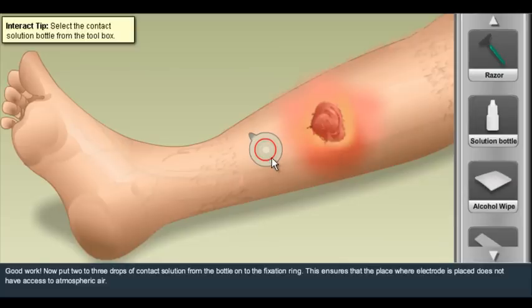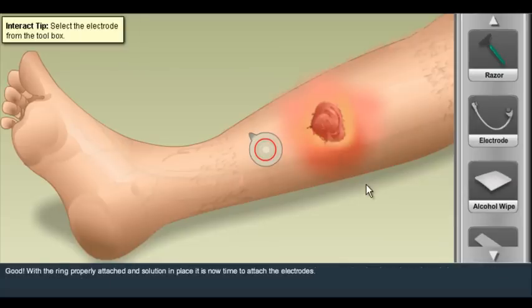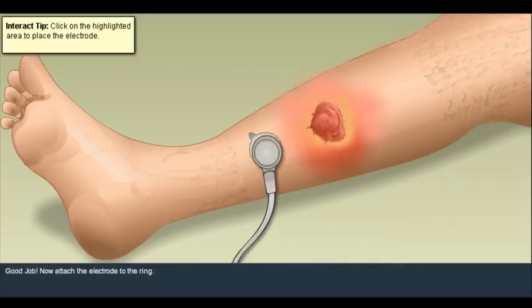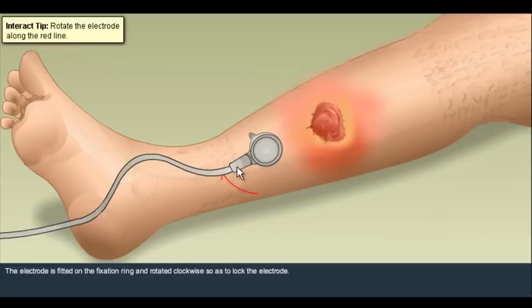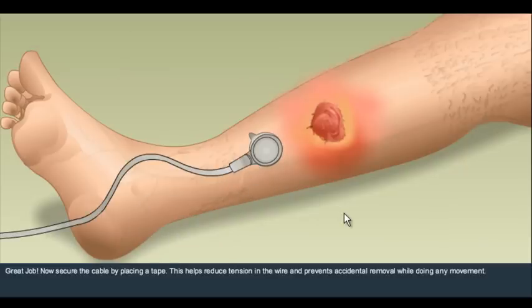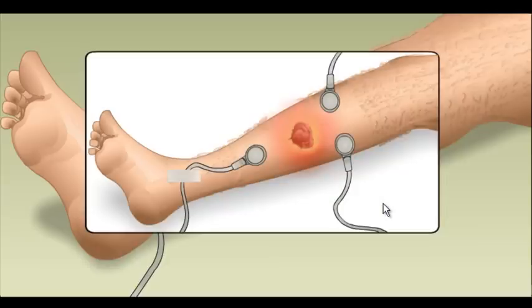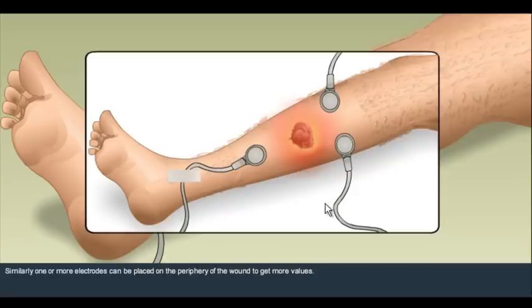Interact with different components of TECOM and learn how to use them during the process of COM measurement in a real-life-like environment. Interact and learn how to place the electrode around a wound.